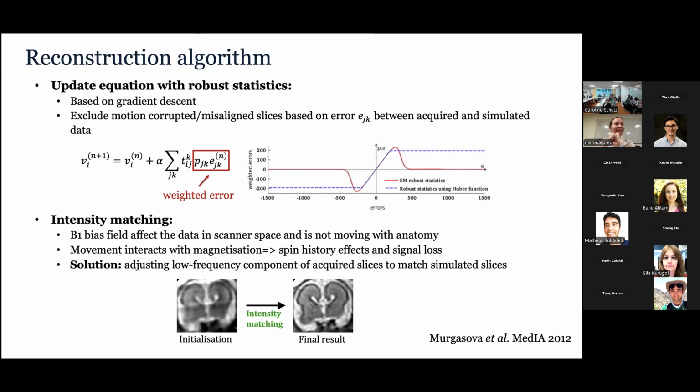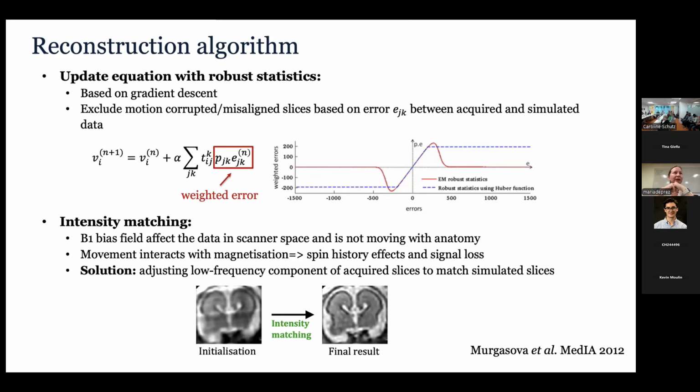Yeah. And I think it can be switched on Siemens, but we were trying to do it for cardiac and we had a medical physicist who said, I don't want to switch it on because it can be misinterpreted if it's wrong. If you look at the lungs and left and right are differently colored, it could mean there is an abnormality and then the doctor can get confused. I'm like, surely if you don't correct it, they get more confused, right?